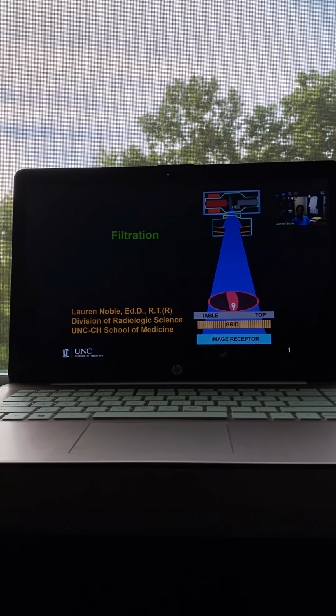But do you remember what is mixed in with the tungsten? Thorium. Yeah, exactly. Thorium helps to minimize vaporization, because that's when the filament heats up. The tungsten gets released in a gaseous state, and then the metal deposits itself on the inside of the glass envelope. I don't know if you remember when we looked at the X-ray tubes in lab, some of the X-ray tubes kind of had a brownish tint inside, and that's from where the tungsten metal had deposited itself inside of that glass envelope.